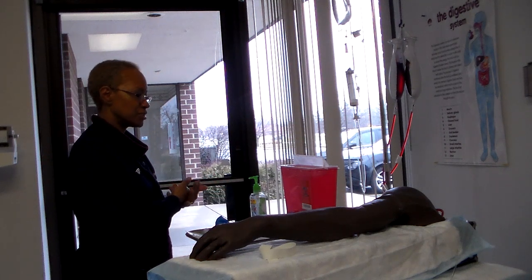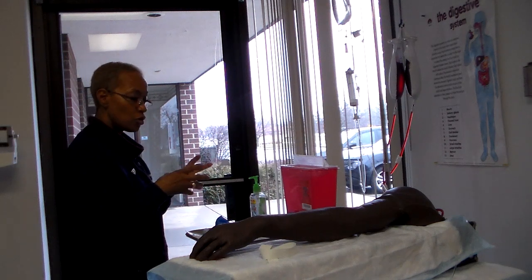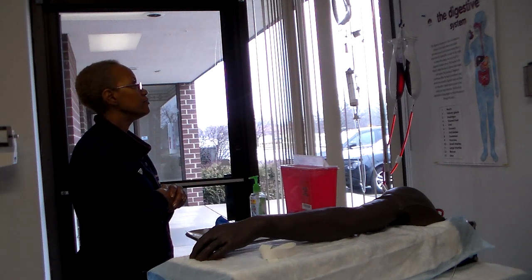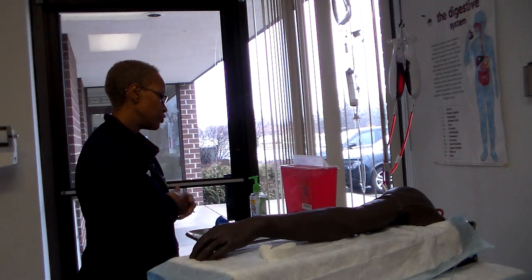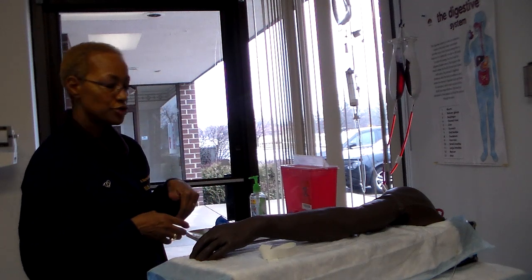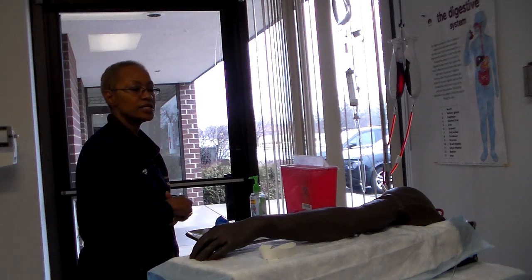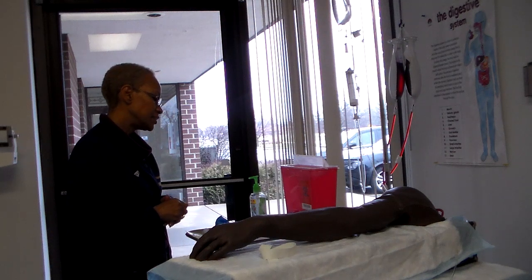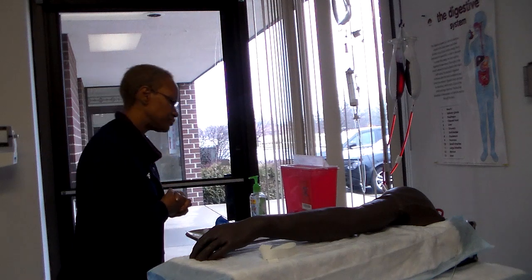You're going to check your patient's name, the medication or the IV fluid, the dose, if it's a 500 milliliters or a liter, whatever it may be, the type of fluid that it is, the time of the infusion, make sure you're hanging it at the right time, and the right route. It is an IV solution, and I think I named all of them.